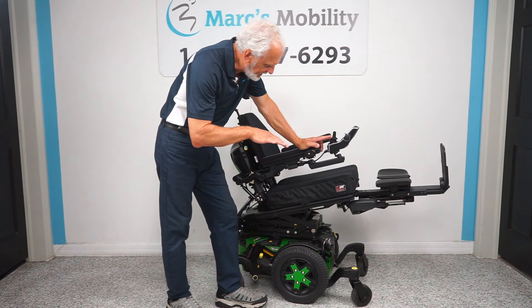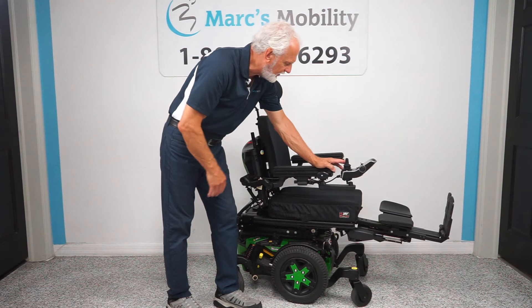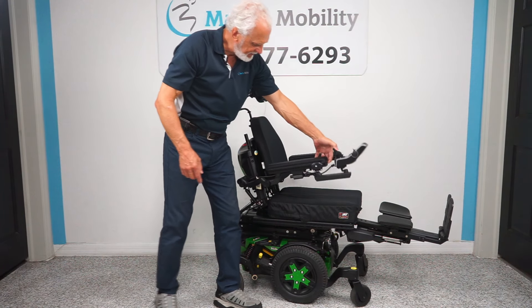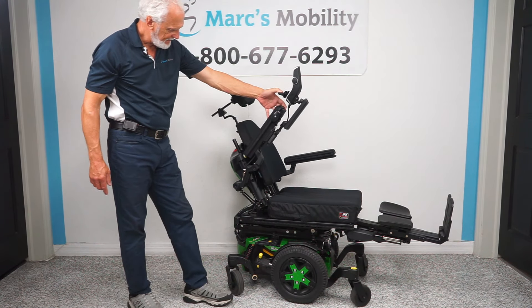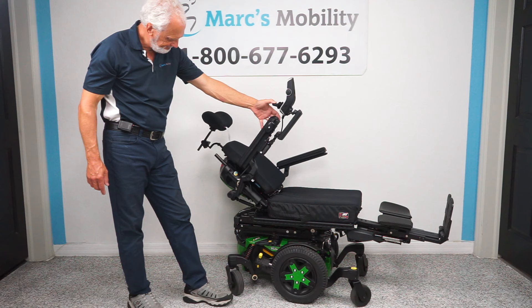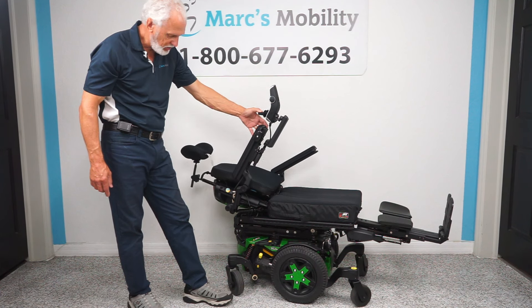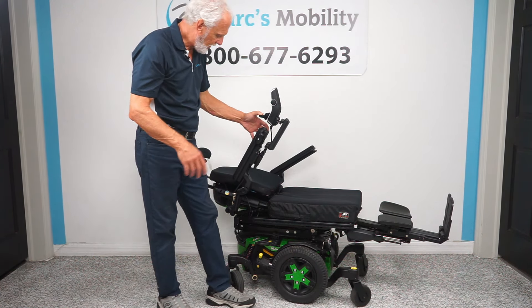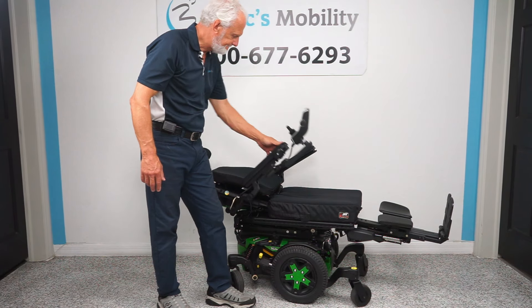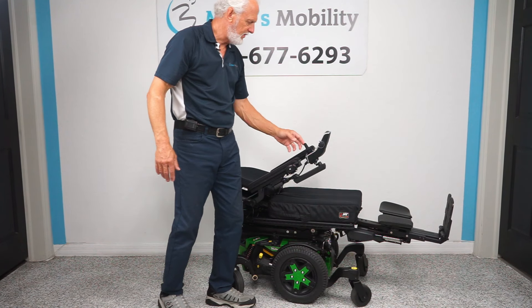So we've done the seat lift, we've done the tilt, we've done the legs out. The last thing to do is the recline — the recline is just the back on here yellow. Push this back and you can see the back going back by itself. This is called the electric recline. These chairs are so amazing and so well built. You can stop at any position you want — I just brought it all the way back but you can go any position you want.